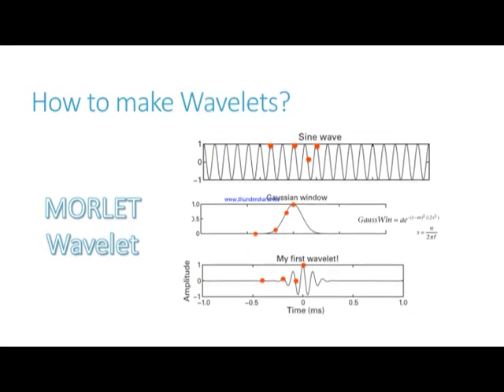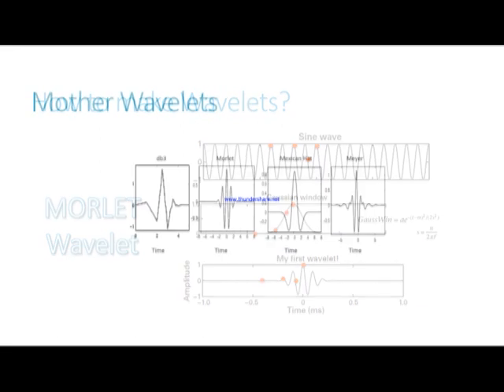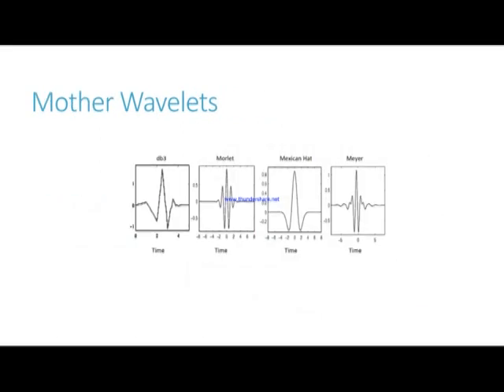Similar to the way a Fourier transform uses many waves of different frequencies, time frequency decomposition via wavelet convolution involves using many wavelets of different frequencies. Unlike Fourier analysis, however, the frequencies of the wavelet can be specified by you rather than being specified by the number of data points in the time series. You can use as many wavelets as you want.